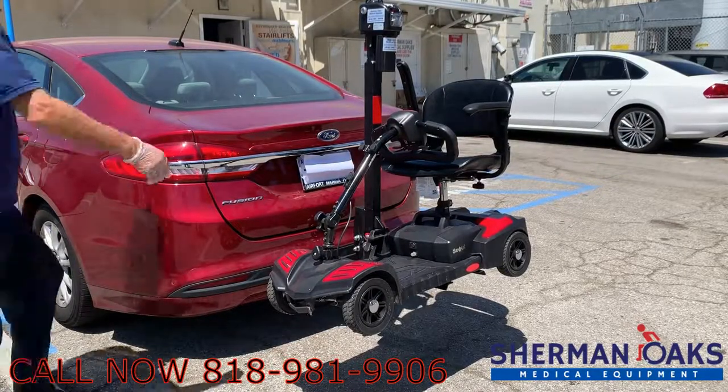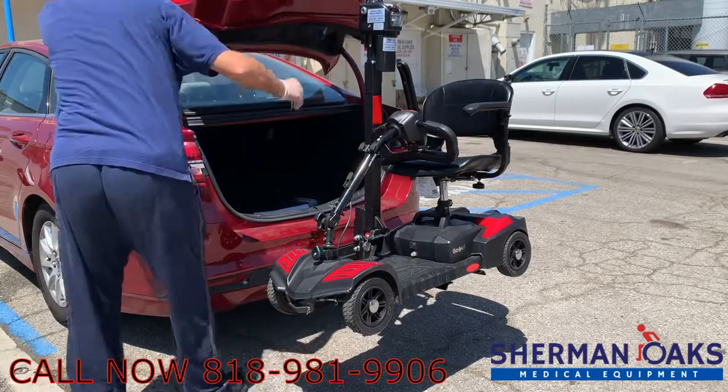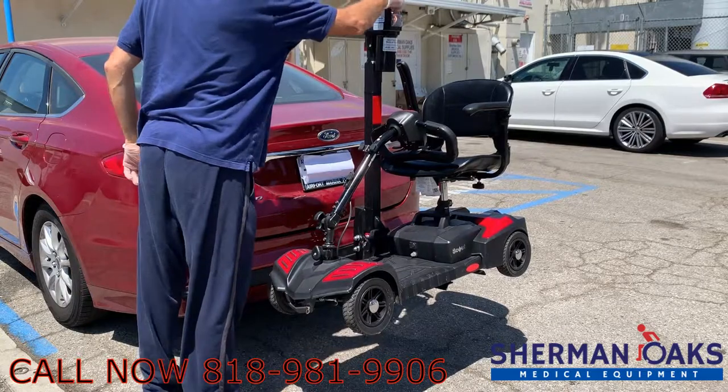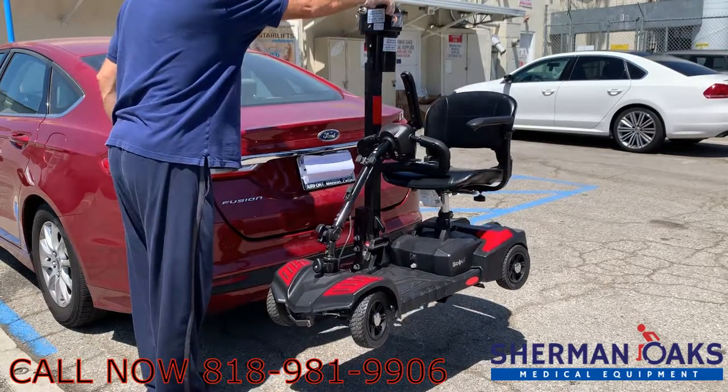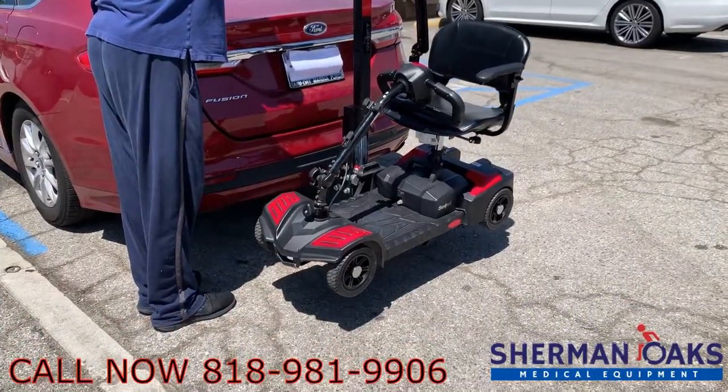Hello and welcome to Sherman Oaks Medical Supplies. My name is Kevin and today we're going to be going over the Tri-Lift Mobility Carrier. This is a carrier that installs into a hitch in the back of the car and then gets wired to the car's battery. It's very easy to use, operate and function to lift any kind of scooter available in the market.